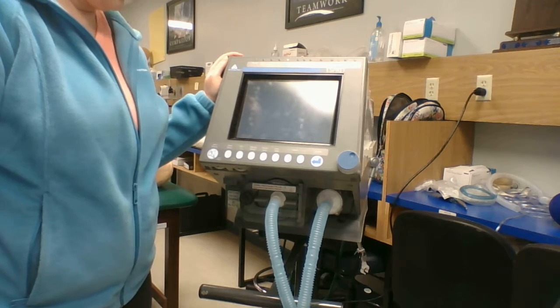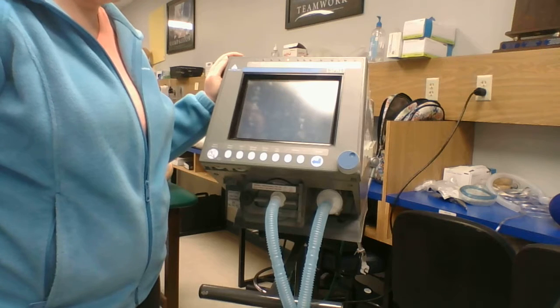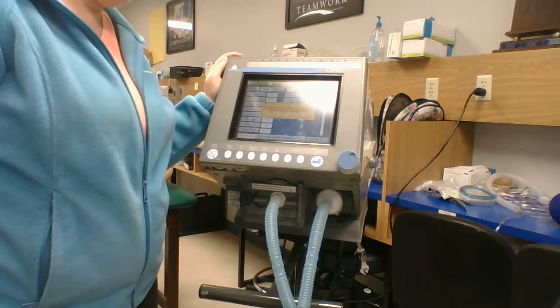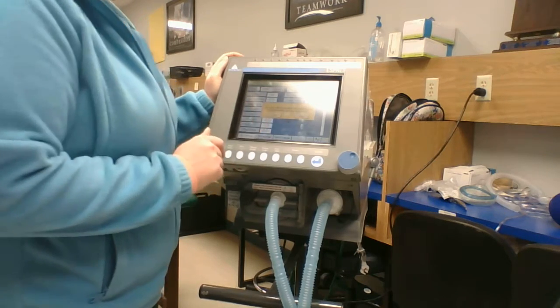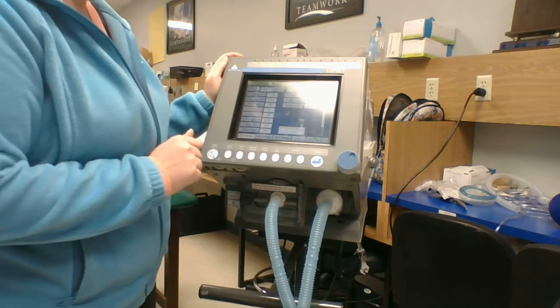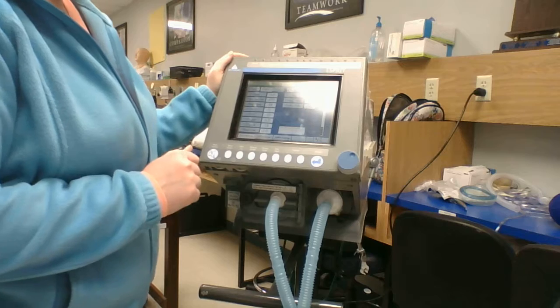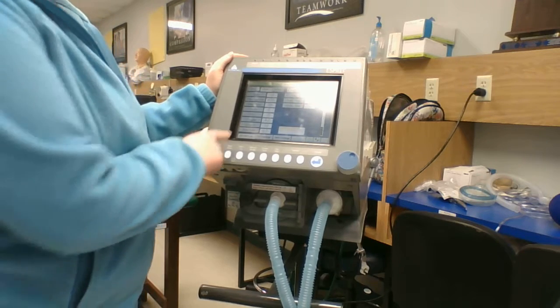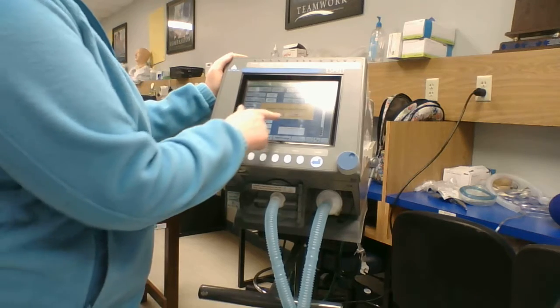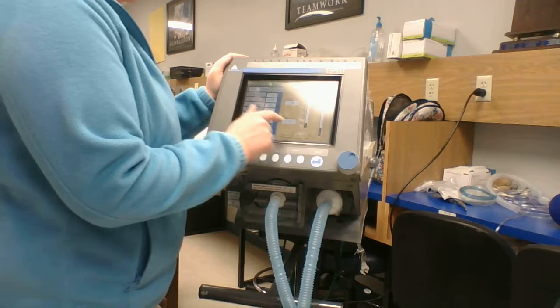And say we have a patient coming in, no lung issues, they're having a MI, so the physician asked me to set the patient up on what mode I want and everything. So since they have no prior lung issues, I'm going to put them on volume control. So up here at volume control, I'm going to put them on a rate of 12.